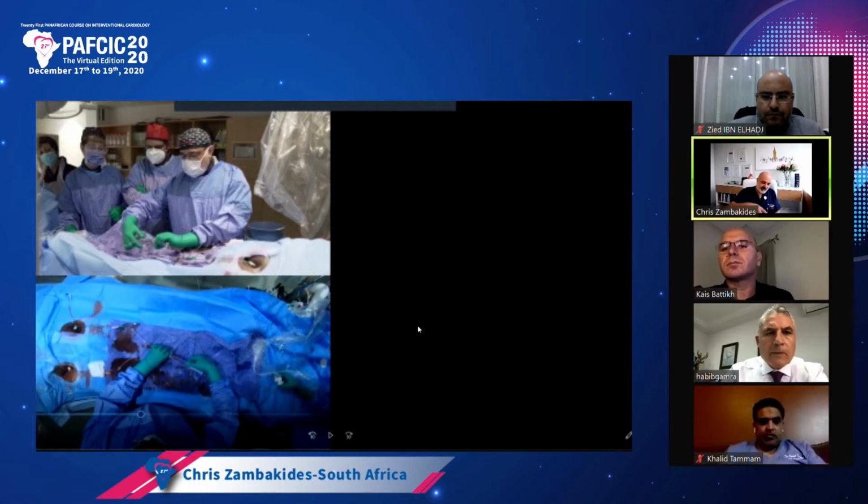Chris, do you need to change the wire sometimes? You're using the same black, right? Actually, over there you saw that I did change the wire. With that first wire, as I went down, it was quite difficult. It looked like it was going in the right direction, and with all the torquing and spinning, it folded on itself and knuckled. When the wire loses its integrity, you don't want to persevere with the damaged wire. So then you can change.